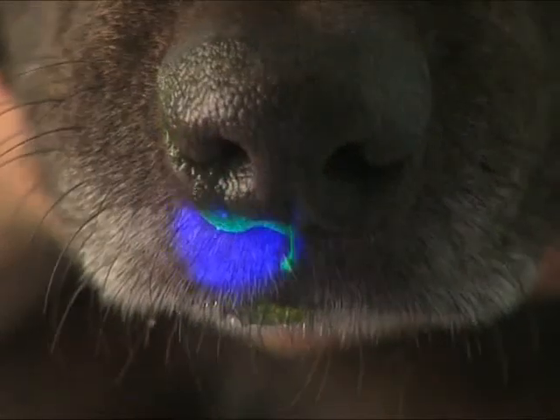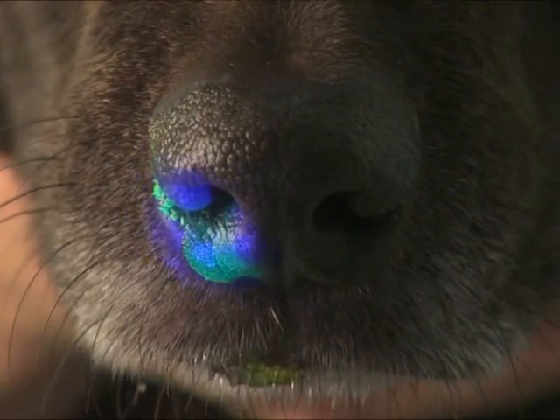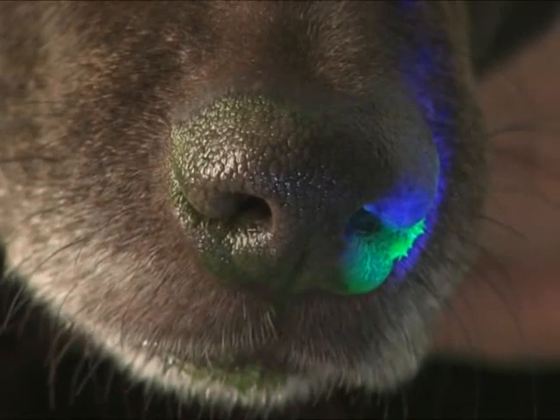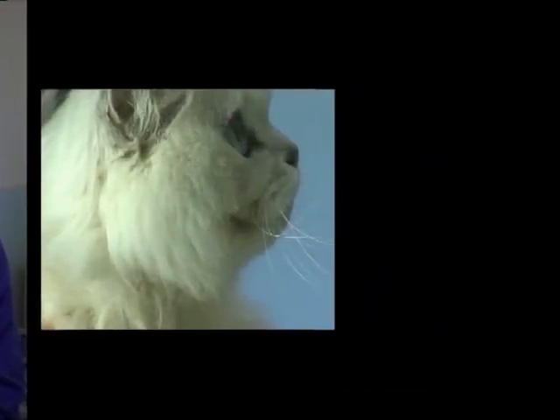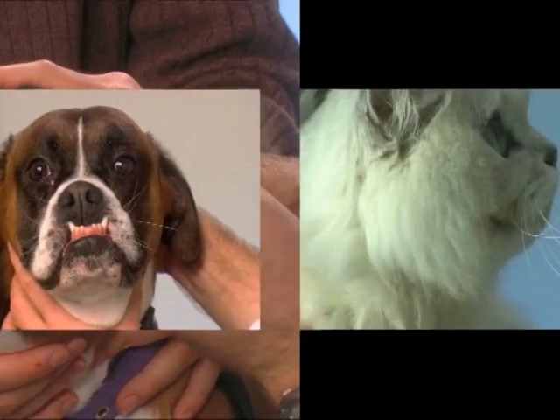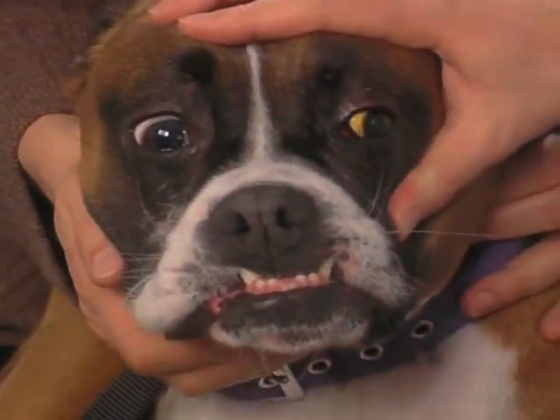In non-brachycephalic dogs with normal tear drainage, dye should appear at the nostril within 4 minutes. Note that there can be normal variation in the time it takes for each side to drain. The main limitation to using fluorescein to assess nasolacrimal duct patency is that not all ducts drain at the nose, particularly in brachycephalic cats and dogs, and 50% of cats in general will have drainage into the mouth. Therefore, if you don't see anything at the nose, it doesn't necessarily mean there is no drainage.